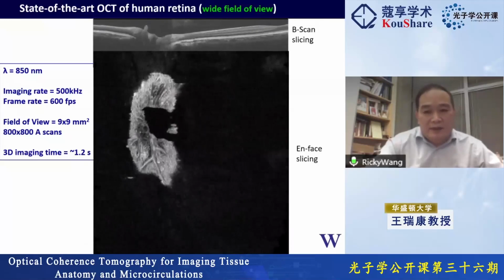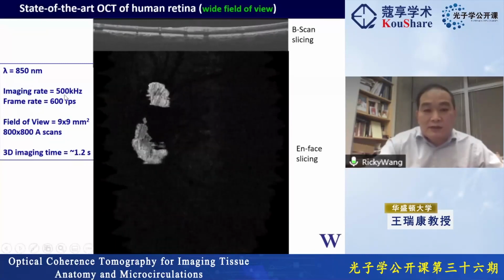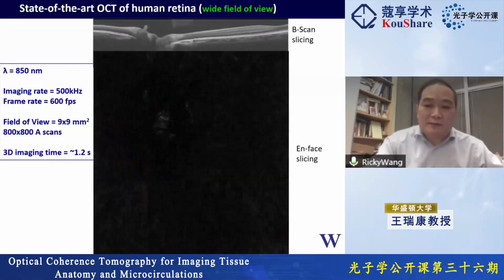However, there is a problem. Within this 1 second, with the system running at 500 kilohertz, you will build up more than 1 gigabyte of data.